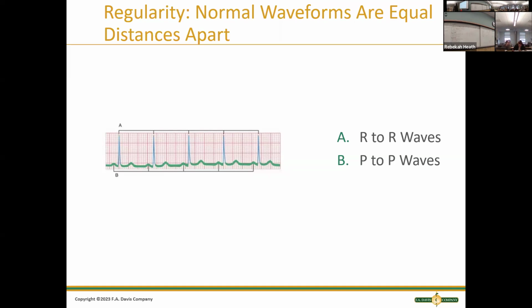Okay, great question. So over here, I want you to make sure one measurement. You start with just one piece and you move that down. You don't keep measuring. So you take this one measurement and then you move it down. Exactly. Make sure they're happening. So I just do one. Beginning of it, another one. Move it down, and then keep going down.